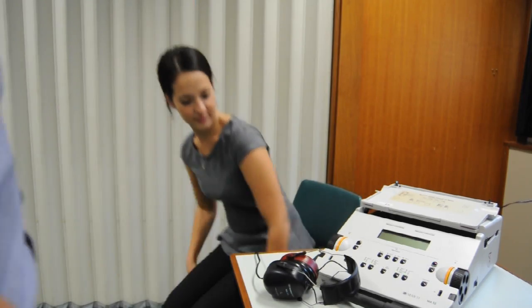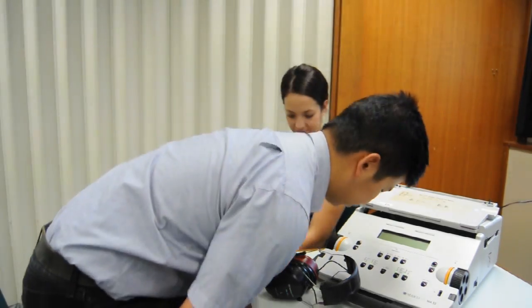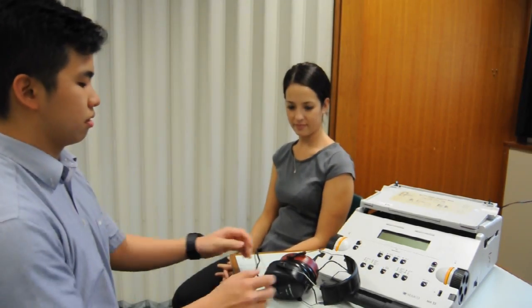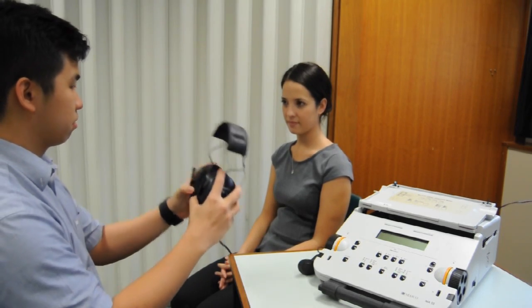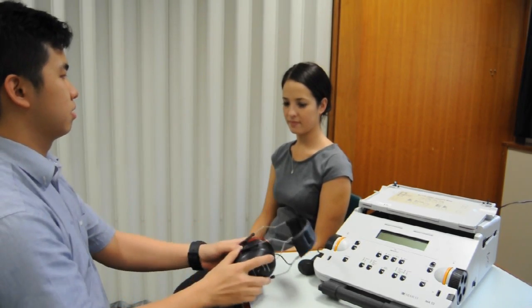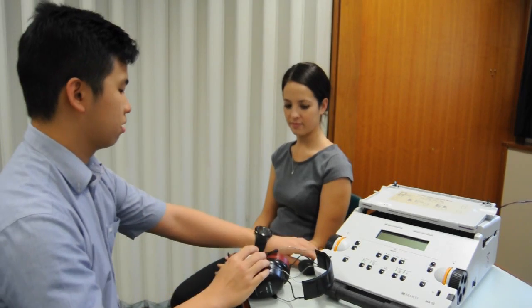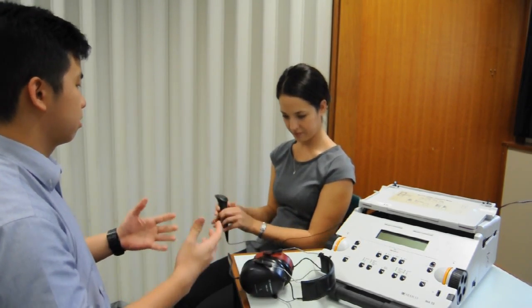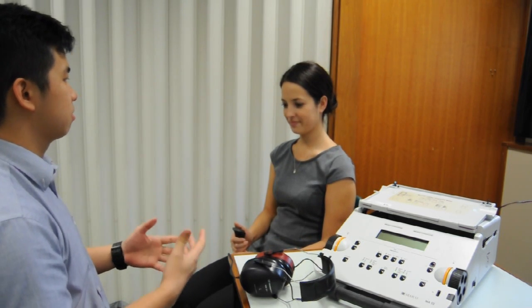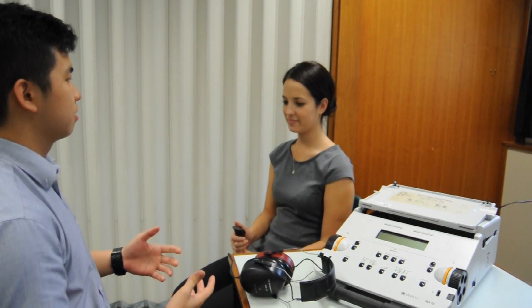Instructions should be clear and concise and given to the client prior to placing headphones onto them. The following information should be conveyed and understood by the client: they are listening for very soft sounds; they should respond every time they hear a sound; they will hear sounds of different pitches; the tones will be heard in one ear at a time; and they need to be informed of how to respond once they've heard a sound. Common response types are to raise their hand, to press a button, to say yes, or a play response in children.